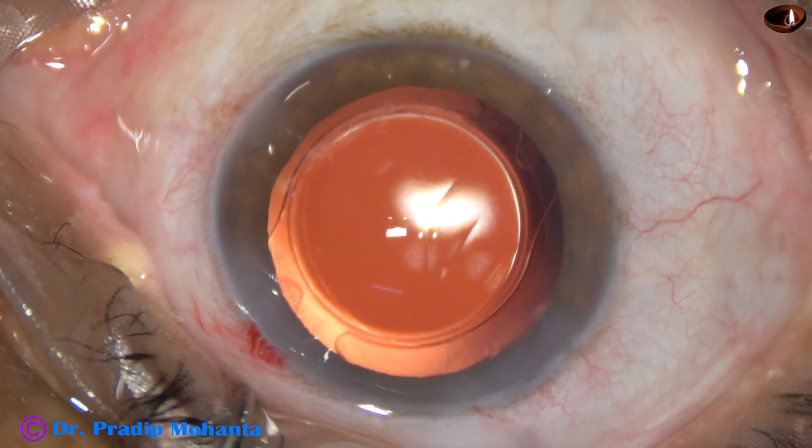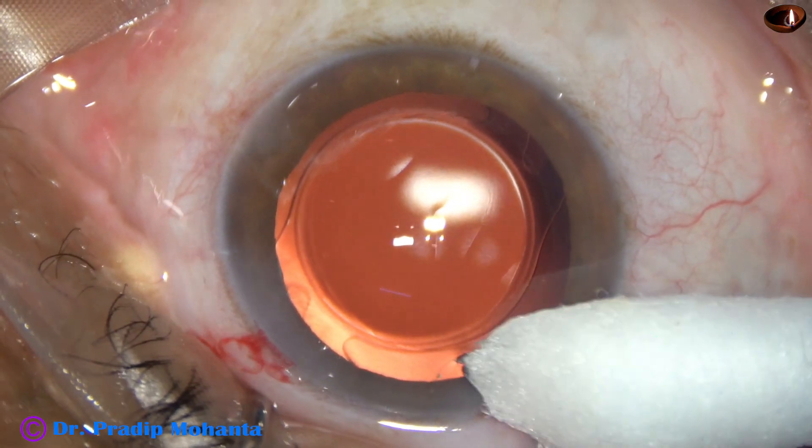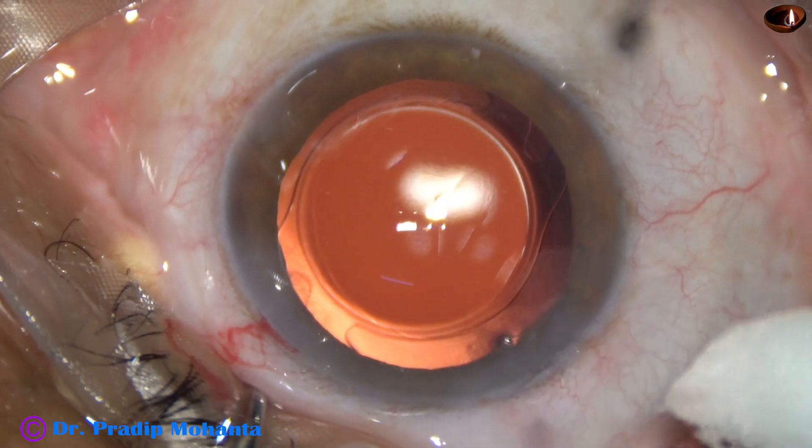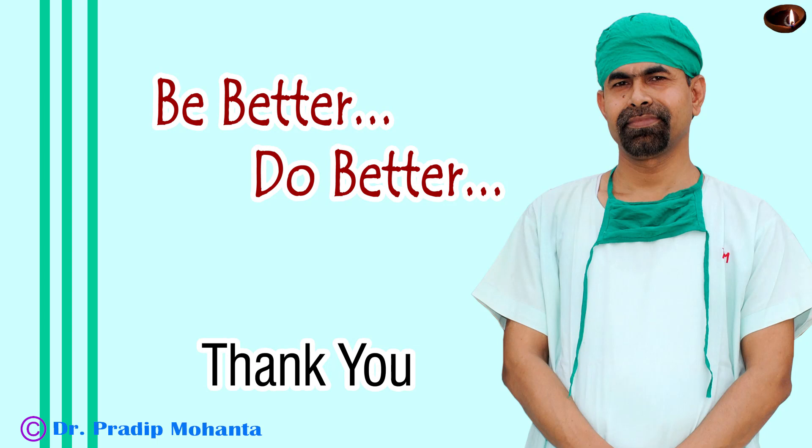The lens is nicely placed in the capsular bag and the anterior chamber is nicely formed. The integrity of all the wounds is checked, and a few drops of moxifloxacin are applied over the ocular surface. The case is concluded. Thank you very much for your attention. Hope this video will help you in developing your surgical skills. Be a great surgeon and serve your patients with love, respect, empathy, and great surgical competence.